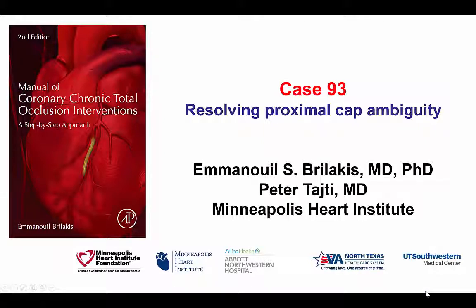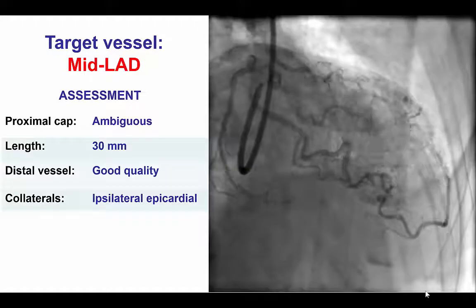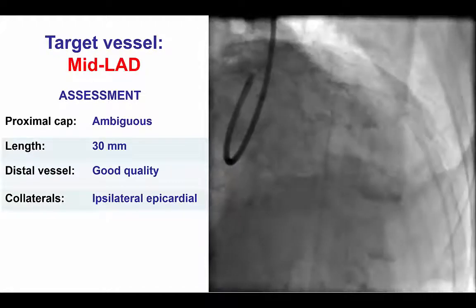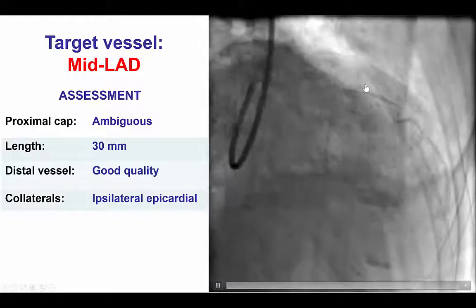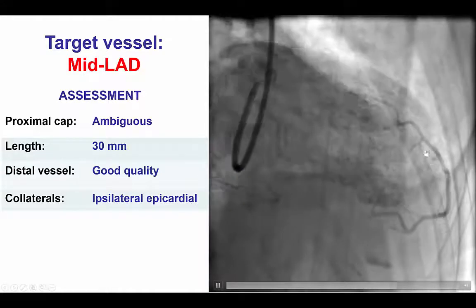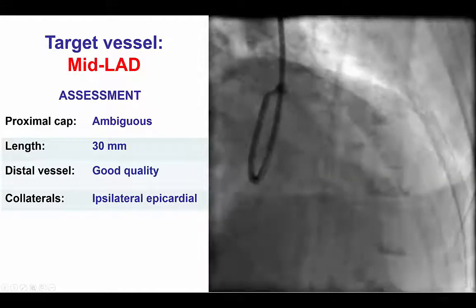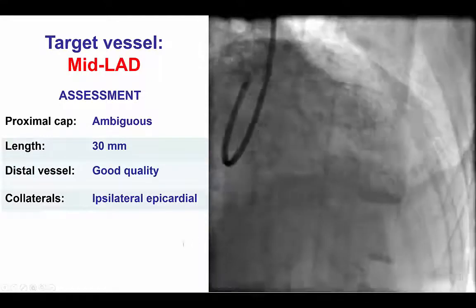This is Manos Brilakis and Peter Taiti from the Minneapolis Heart Institute presenting case 93 for the second edition of the Manual of CTO Interventions. This is a case of proximal cap ambiguity. The patient was referred for CTO-PCI of mid-LAD CTO. The occlusion was at the takeoff of a large diagonal branch and the distal vessel was filling via epicardial collaterals from the circumflex. There was a length of approximately 30 millimeters and the distal vessel appeared to be of good quality.